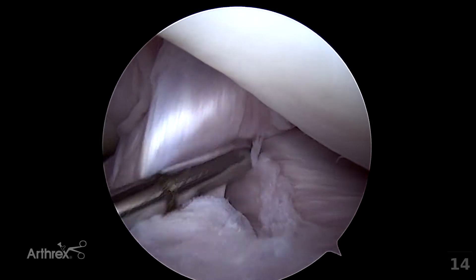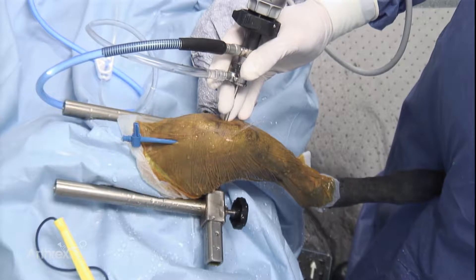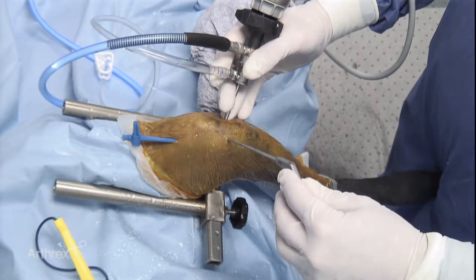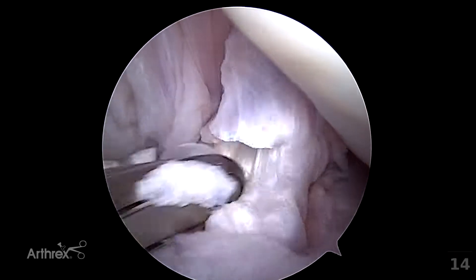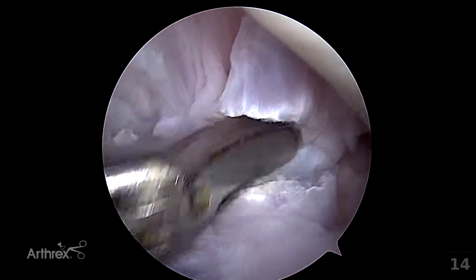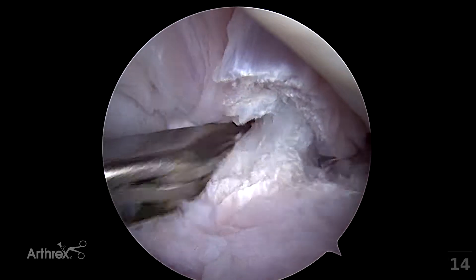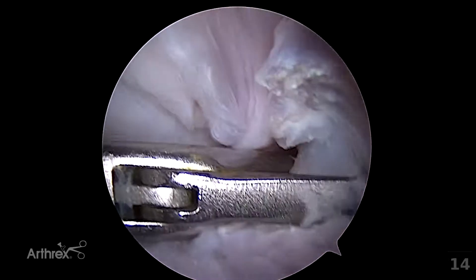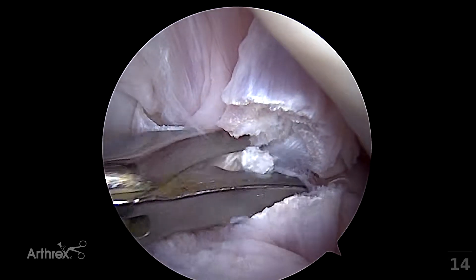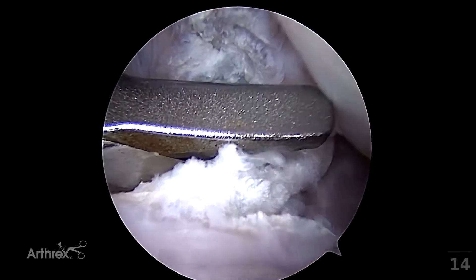A standard punch is preferred for this process. The standard punch is placed into the joint and the action of the punch is activated only when visualized. The punch is used to progressively resect the cranial cruciate ligament. It is important that the caudal cruciate ligament is identified visually and protected during this process. Bands of the cranial cruciate ligament can be tensioned until the ligament is completely transected.